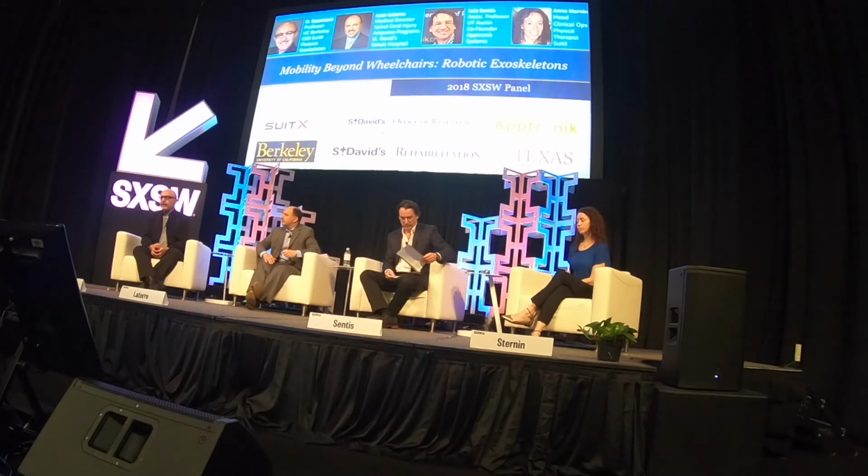The question he is asking relates to the industrial exoskeletons that we have developed. Those devices are completely different from the medical exoskeletons you just saw here. Those are not medical devices. Those are devices that reduce the risk of injury. They reduce the compression force in the spine during bending, and they reduce knee joint forces during squatting. These are the tasks that workers do. They put their bodies through abuse all day long. I'm very lucky to sit in front of a computer and do analysis, and that's rather easy. But those guys work very hard, 8 hours a day in a very harsh environment. So we are designing very low-cost, accessible exoskeletons to reduce the risk of injuries.